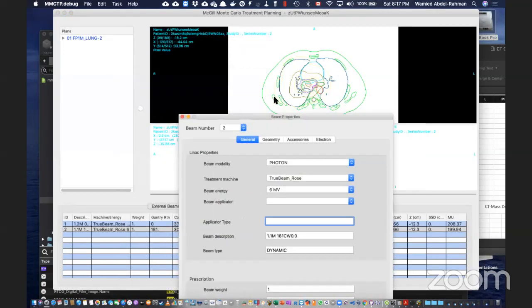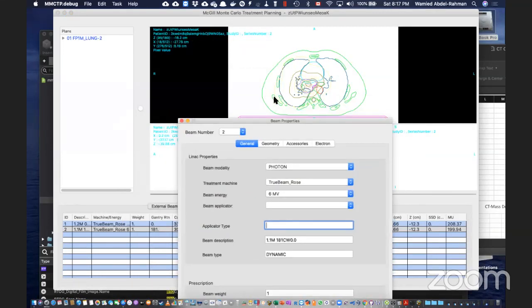Yeah, I think this plan is not a 6. This plan is a 6 MV, and it will show up as a 6, because I have changed something in my field, the label on the beam. But you see, this is a 6 MV, and I got a 6 label. This is a new label generated because I've imported this new CT. Right.